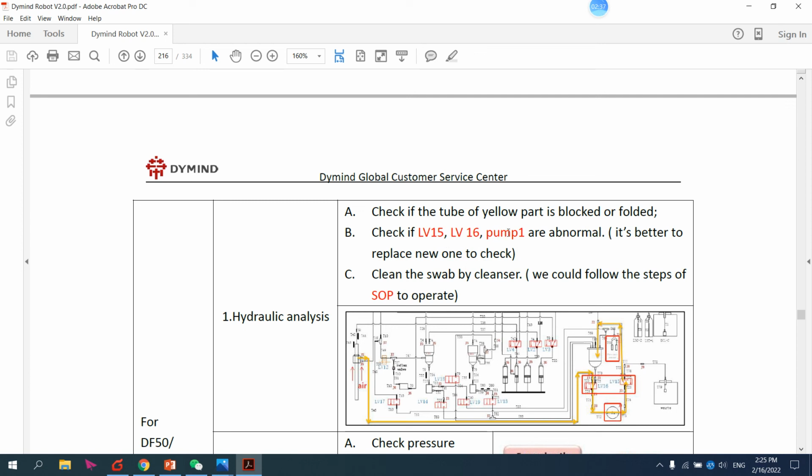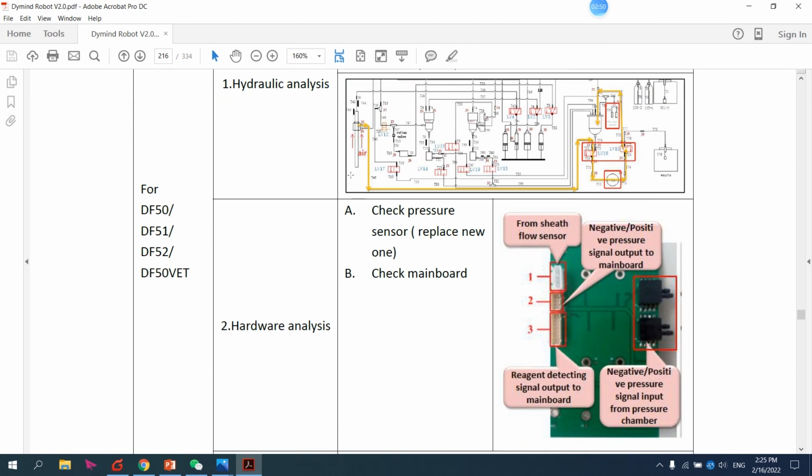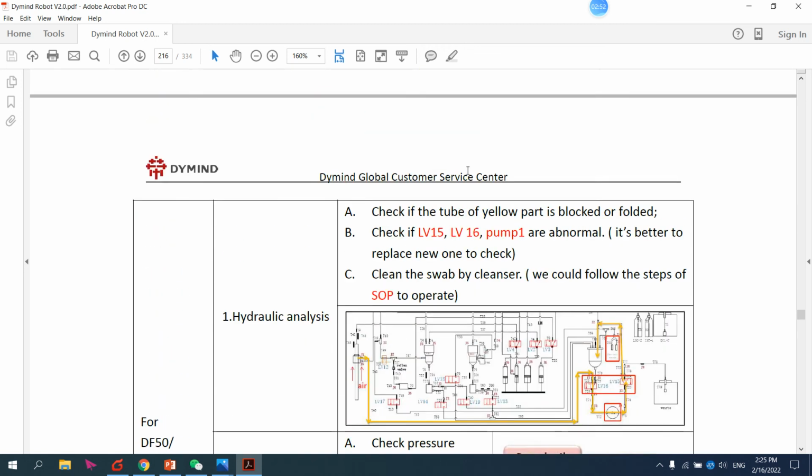But mostly we recommend that there is an inside membrane, check the membrane. If the membrane is damaged, you can replace the membrane and fix the problem. These are the C options. So this is how you can use our Dymind file. Thank you.